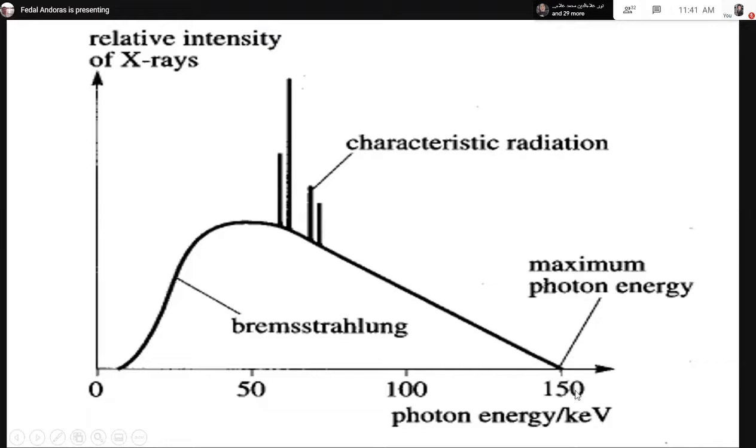من توصل إلى 150 and over، حتى إذا توصل 200-300 لا maximum photon energy، يعني الحد راح ينقطع، يعني راح يوصل حد الإشباع. Even when you apply more and more than this, you will not get much more X-ray than the 150. So هنا عندك الماكسيمم.